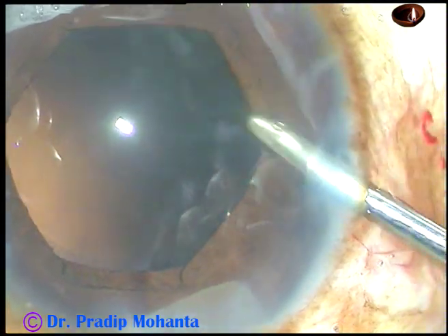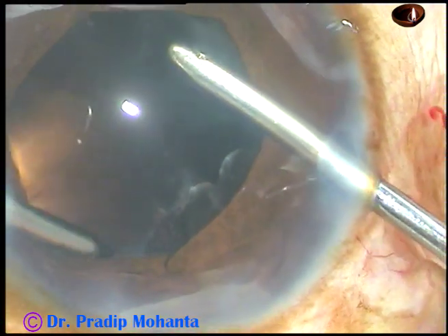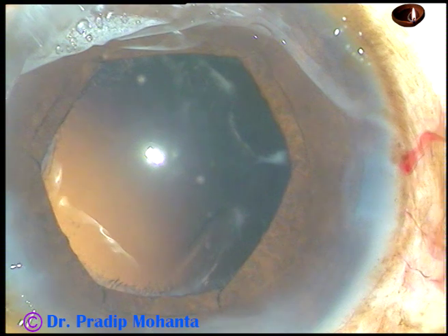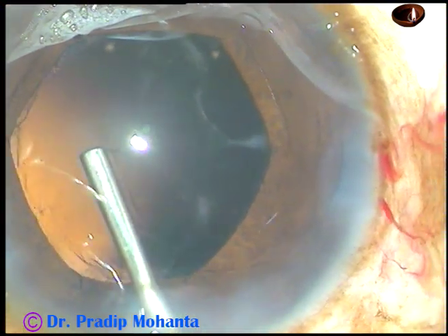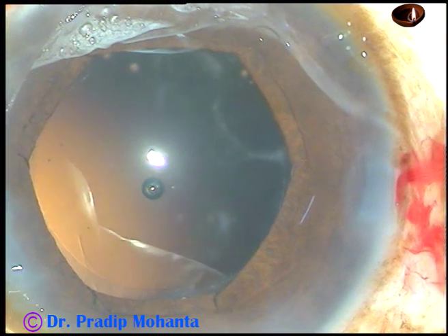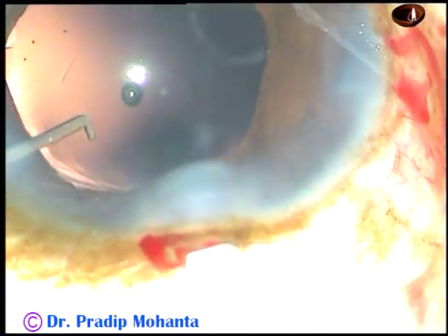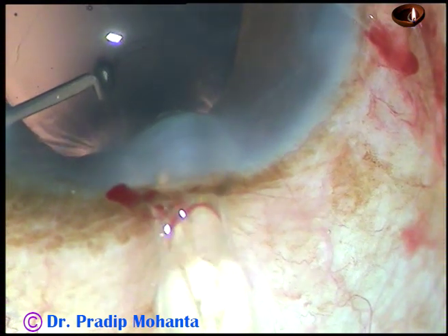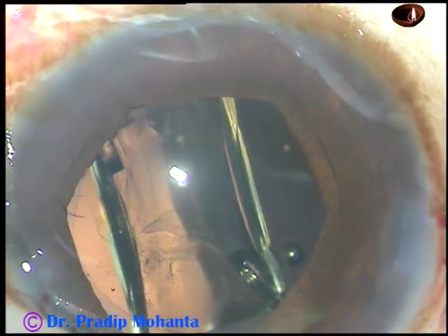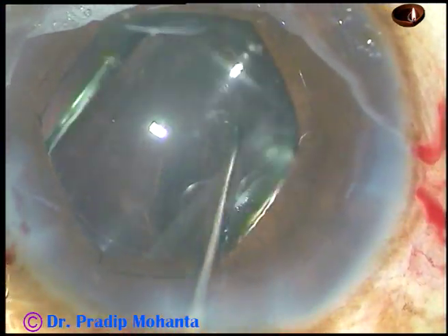Now clean the cortex in whatever way you are comfortable — bimanual irrigation aspiration, coaxial irrigation aspiration, or a simcoe cannula for cortical cleanup. Then inject viscoelastic. When there is a pupil expansion device, you should inject viscoelastic and then inject the lens into the capsular bag. The lens should be injected so that the trailing haptic goes into the bag in one go. The left-hand instrument should guide it to place the lens in the capsular bag in one shot.